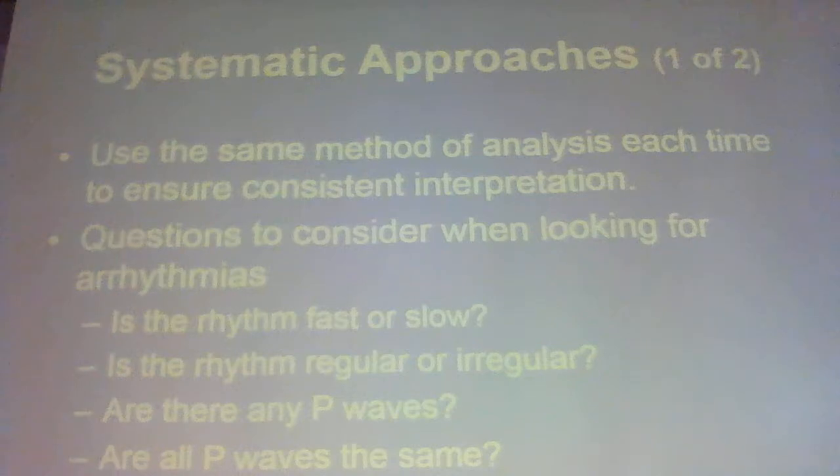We're going to see if it's a box taller or not. If it is, we're going to put a check mark by it. We're going to go through all the leads. AVR should be negative. The whole thing should be upside down because it does not have a partner. And then we'll go back and anything that's got a check mark by it, we see if it goes together.